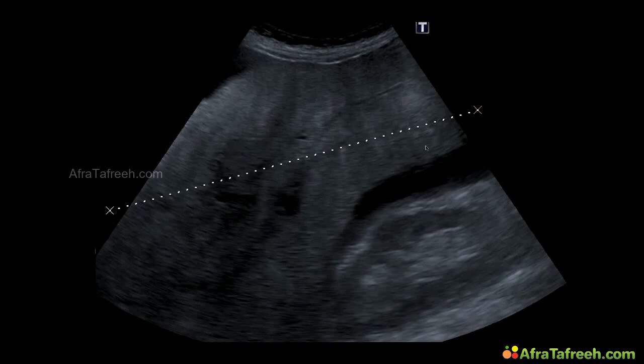In this picture, we can see easily that the liver is enlarged too. We can compare it to the right kidney over here, and we can easily see that the inferior border of the liver is reaching more caudal than the inferior pole of the kidney over here. So that's a sign of cirrhosis too. The liver can be enlarged. In very advanced cases, it can also be shrunken a little bit smaller. But in this case, we can see an enlarged liver, especially in comparison to the kidney.